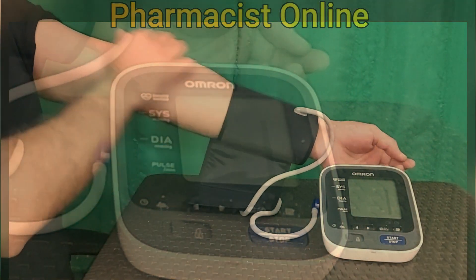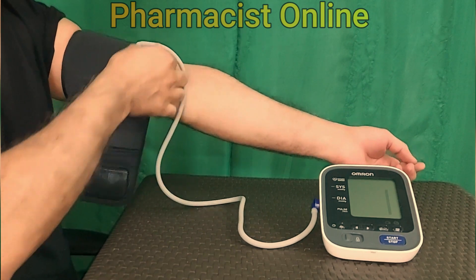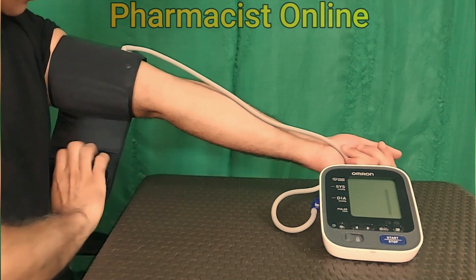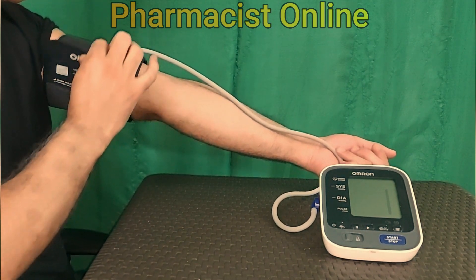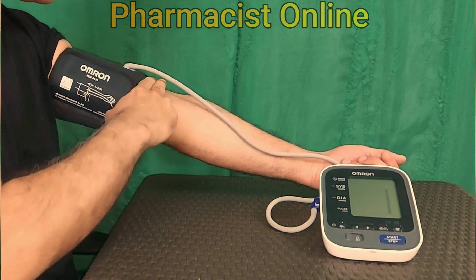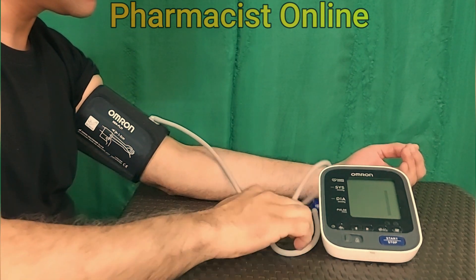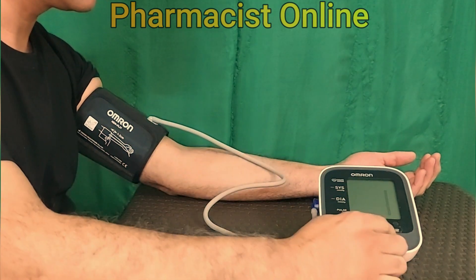If you think your BP monitor gives a wrong result, you can measure BP again with at least a 15-minute interval. By keeping a finger between your arm and the cuff, you can check that the cuff is not wrapped too tight. Sometimes you can get different BP readings if the cuff is wrapped too tight or too loose.